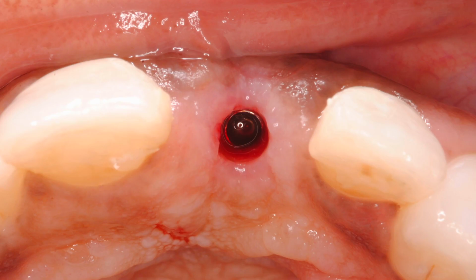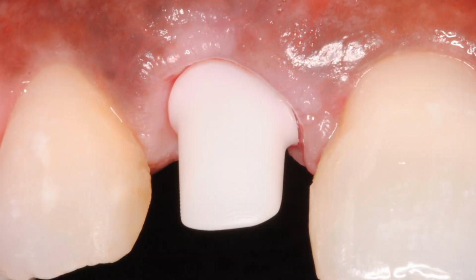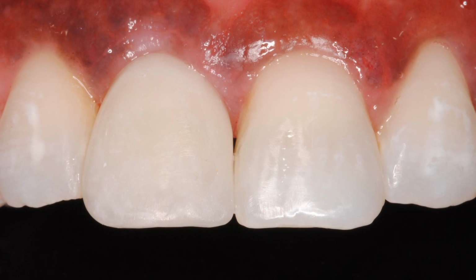Now, I do that many times in my practice. Sometimes the day of implant placement, I just use a regular healing abutment, and then 15 days prior to making a final impression, I may add some composite to the healing abutment, and with that I'm going to modify the shape or the contours of the tissue around my implant.